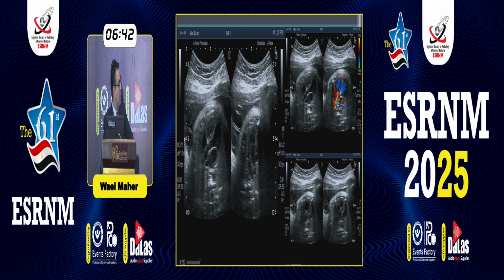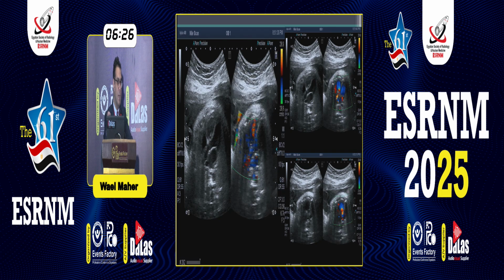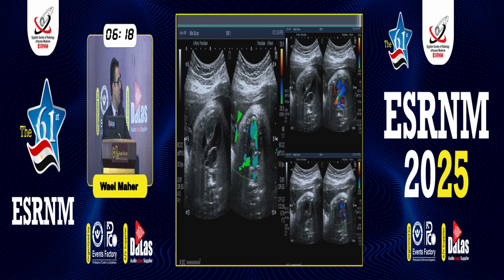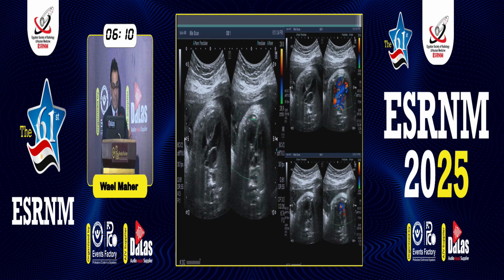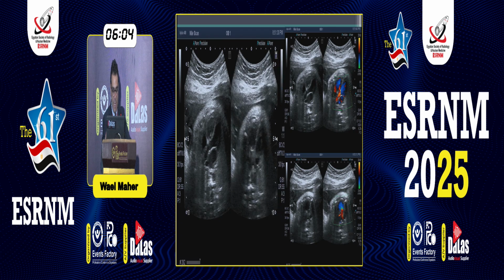In this view, I would like to show you quickly, if you see the large one, here we will bring the LVOT, that's the LVOT, and the RVOT. I will regain again. That's the RVOT and the LVOT. So as you've seen, it happens in fractions of seconds. Just 3 seconds, you can see the LVOT and the RVOT. So you should be aware of what you're looking for. You should be acquainted with that the right side coming from the right, bifurcation, and the left side like the ballerina foot. So all can occur in seconds, and you can get back to it to demonstrate the LVOT clearly and the RVOT clearly.